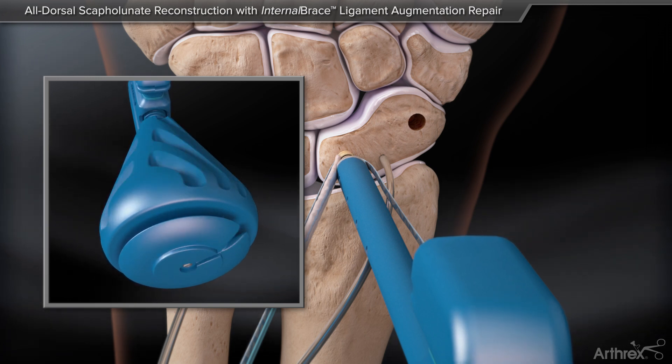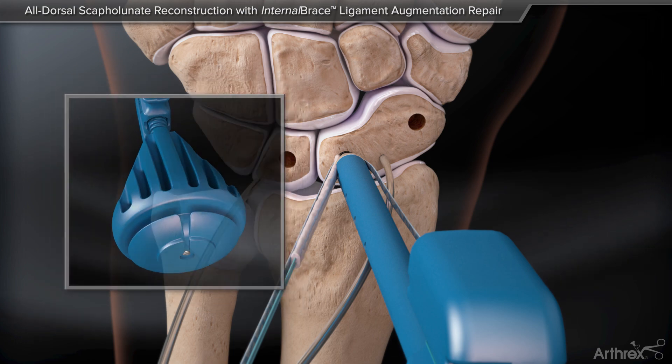Hold the tab steady while turning the knob clockwise until the anchor body is fully seated in bone.